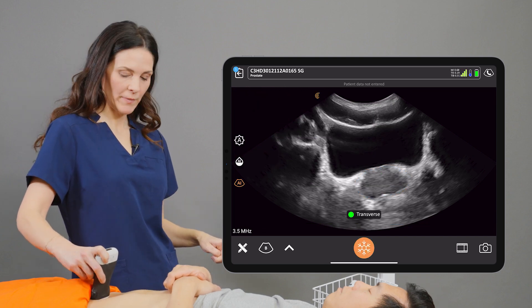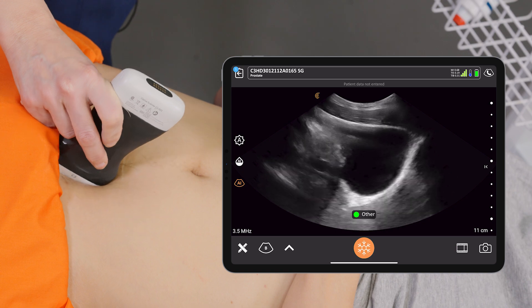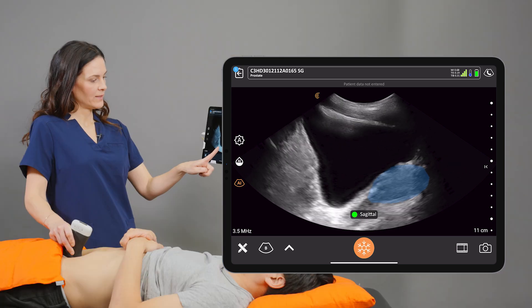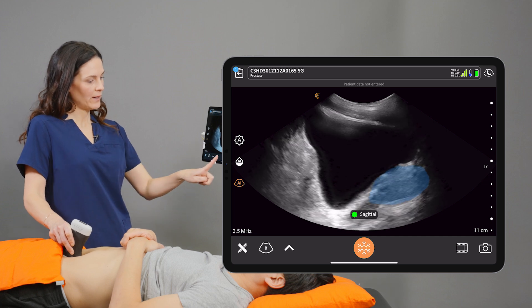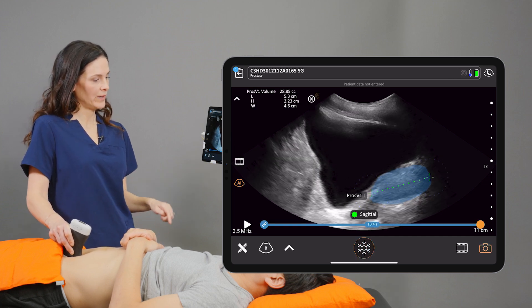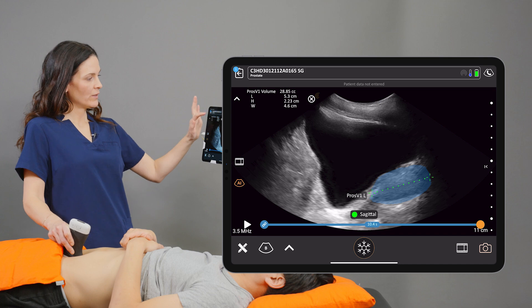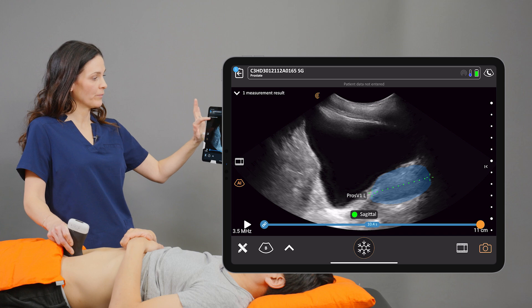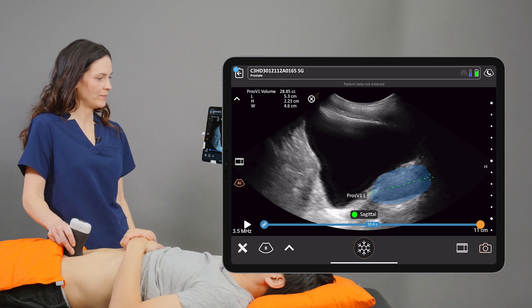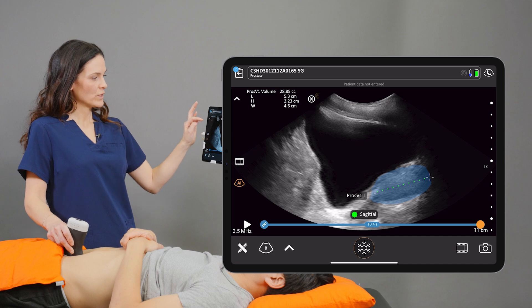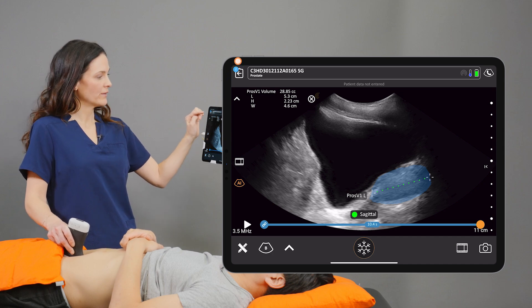We'll tap the unfreeze button and I'll rotate my scanner 90 degrees into the sagittal orientation. The sagittal label has been placed for me and when I select the Freeze button the caliper is automatically placed. On the top left hand side of the screen we can see all three of those measurements along with the prostate volume has been calculated on the screen. When I save this image those measurements are transferred to the Clarius cloud.